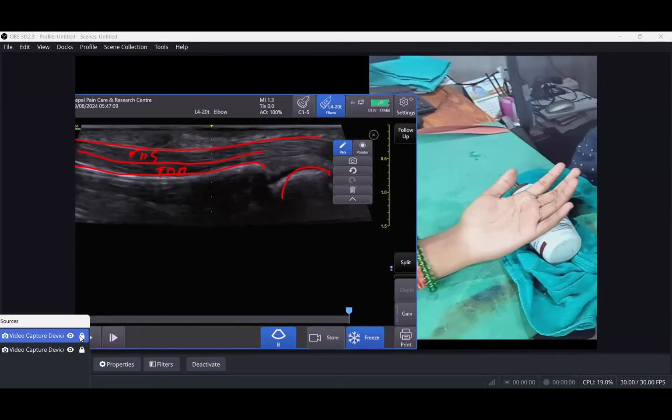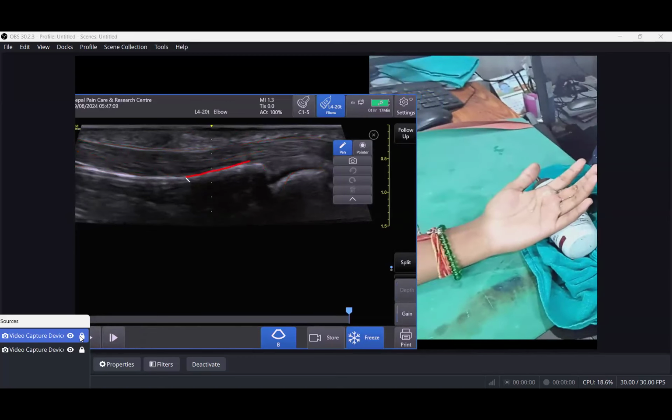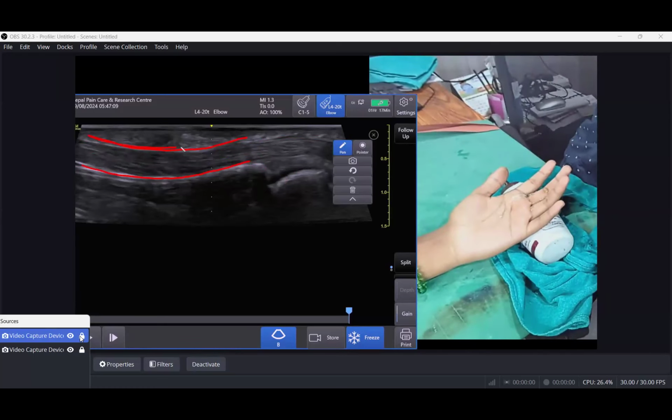Okay, here, if you notice, the tendon is like the bone. The curvature of the tendon is closely associated with the bone because of the pulley. Because this tendon is reinforced to the bone with 5 different pulleys. So this is A1 pulley. This is A2 pulley. It is like a belt.